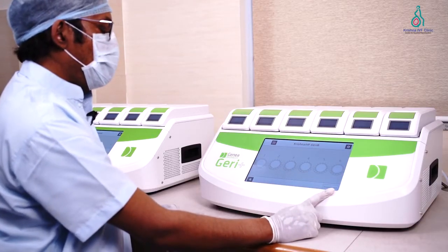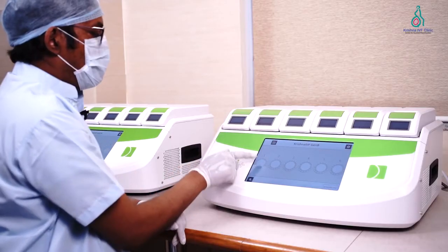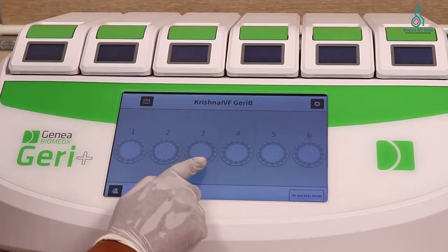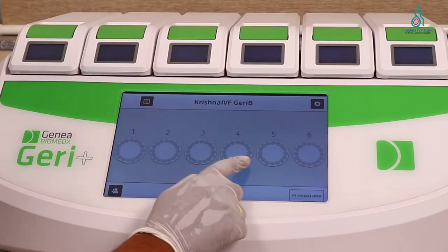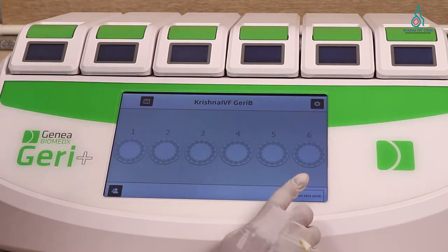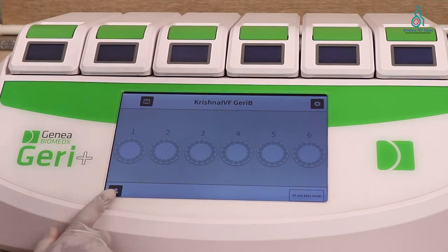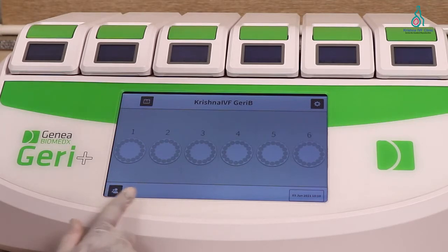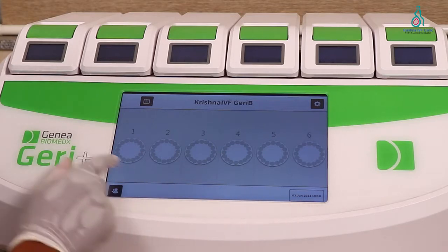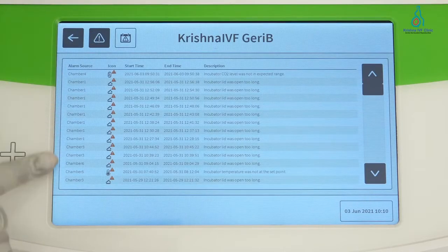This is the main screen of the Geri Incubator. These are the 6 chambers: chamber 1, chamber 2, chamber 3, chamber 4, chamber 5, and chamber 6. On the right hand side we can see there is time and date, add patient, and date and time. This is the alarm key — if any alarms are present we can see them here.